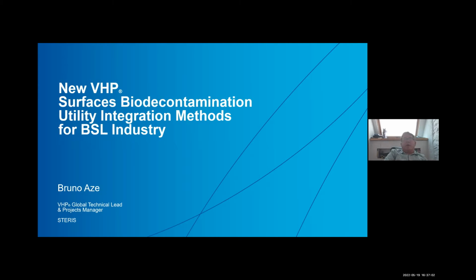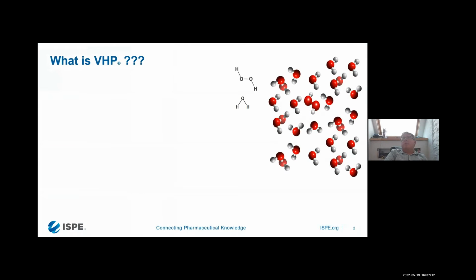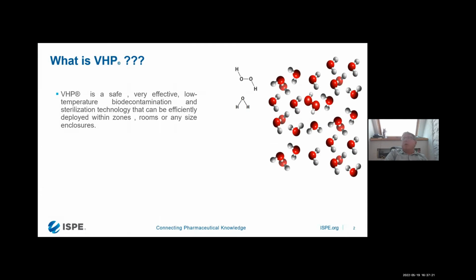But first, let's talk about VHP in general to get everybody up to speed. So what is VHP? VHP is vaporized hydrogen peroxide. So this is a combination of H2O2 and H2O.